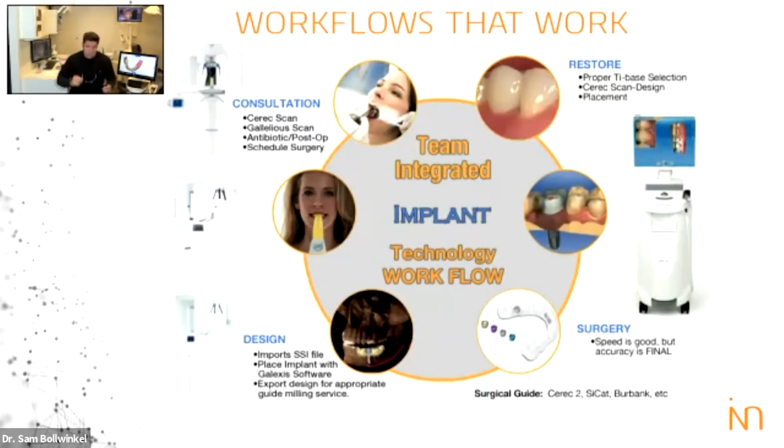As we know, dentists, we are a little bit controlling. It's hard to give up control and push out. I guess the term would be giving up the control nature of our business. And so using a third party, taking some scans or impressions, sending out, having a lab, and just being disassociated from that concept can sometimes be difficult. We run into problems. I know I did over the 20 years of my career prior to introducing technology. I would get different things back from labs, and there would be some distortions, there would be some issues. Is it on their side? Is it on my side?